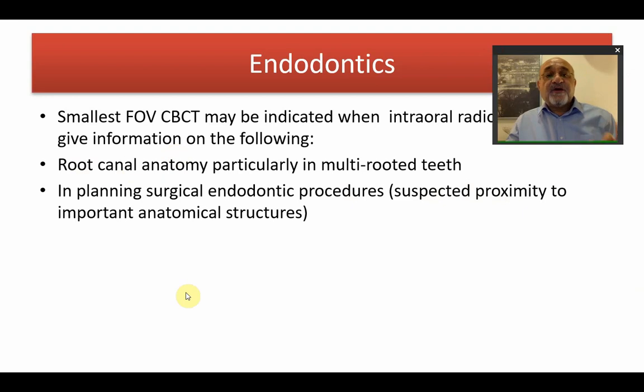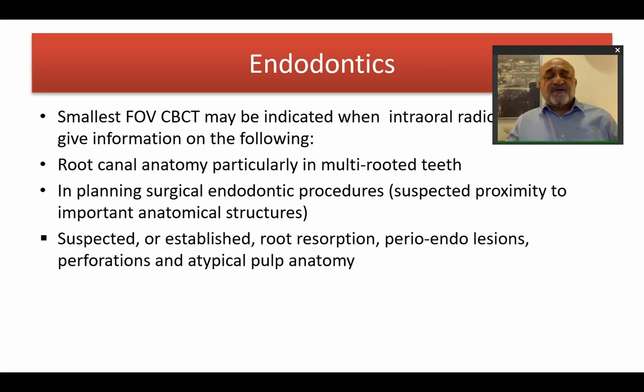If you're going to do endodontic surgery and you suspect proximity to some vital anatomical structures, say the inferior dental canal, the maxillary sinus, any lesion or any structure that might be affected, and you feel that there is a danger of affecting this anatomical entity by your procedure and the intraoral radiograph failed to show you this, then go for the CBCT.